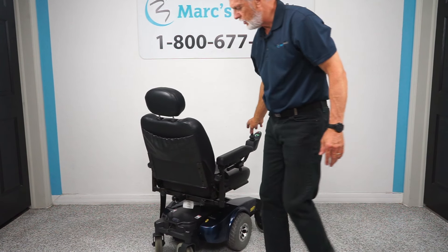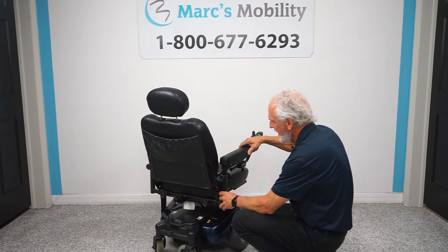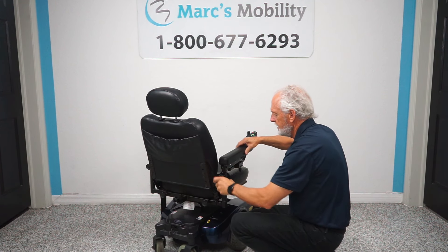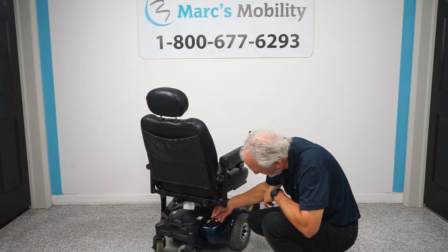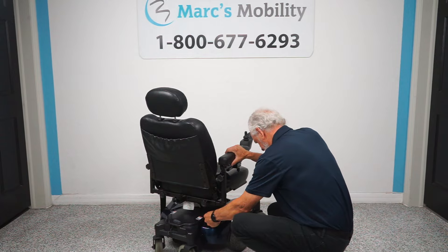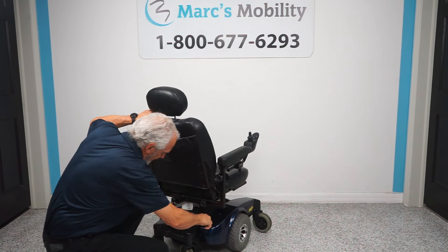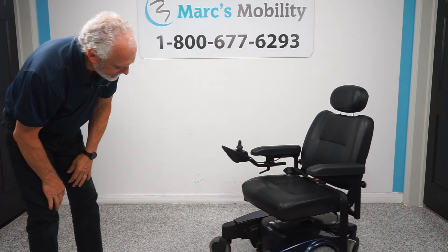Of course, you have two motors on this chair. If you want to put this chair in neutral to push it, you turn the power off and right here there's a lever — there's a little sticker, pull it out, you might have to shake it a little bit. Pull the lever out on both sides and now you're in neutral.